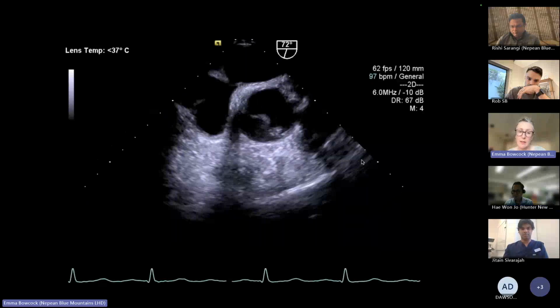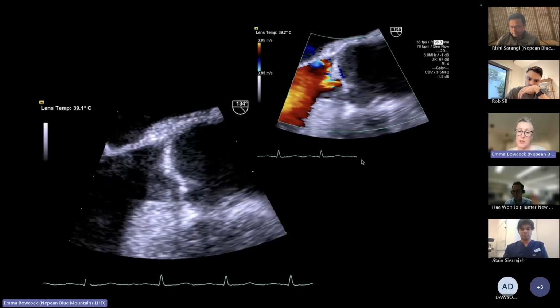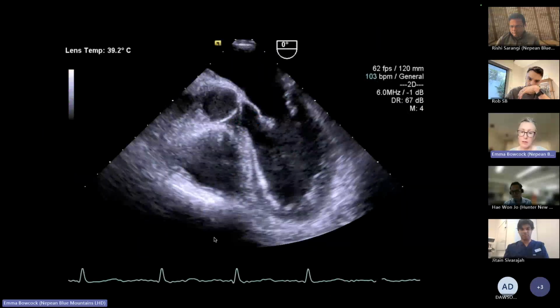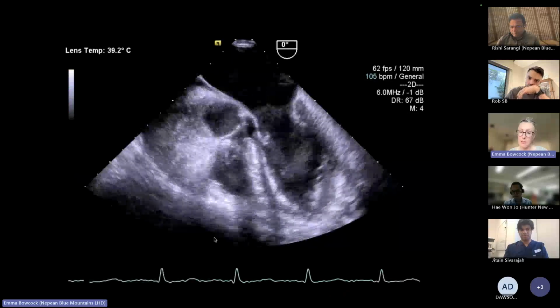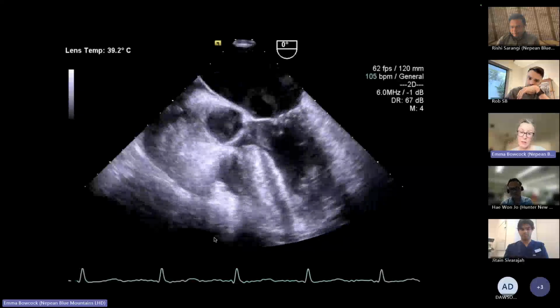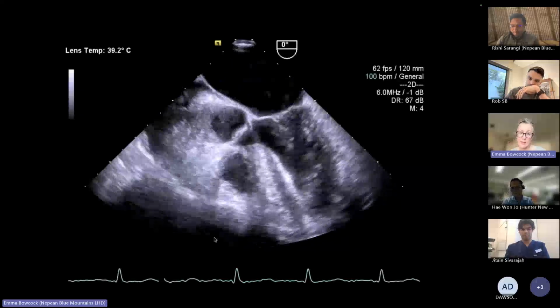I think you did really well. Iatrogenic aortic dissection following an angiogram. Probably what's happened is, I might just go back for everyone. Mid-esophageal five-chamber, as you said, hyperdynamic function. The RV looks okay as well, right? She had an inferior RCA stent, I think.